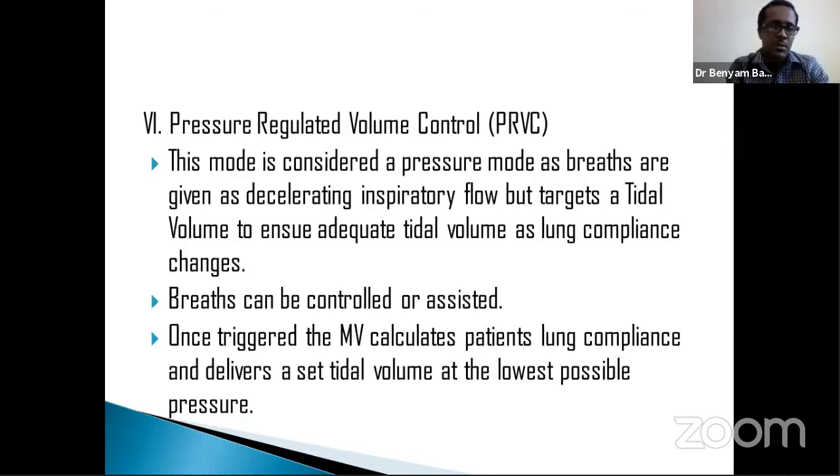So breaths could be controlled or assisted, as in the others. But the difference in PRVC, pressure regulated volume control, is that the mechanical ventilator does all the calculation for you and usually delivers the set tidal volume at the lowest possible pressure. So it prevents lung injury. This is a newer modality, so you might not find it in all ventilators, but if you do, it's wonderful, because it does a good job for you. You don't have to sit down and monitor the peak inspiratory pressure or the plateau pressure every time, because the machine will be doing it for you and giving you an alarm.